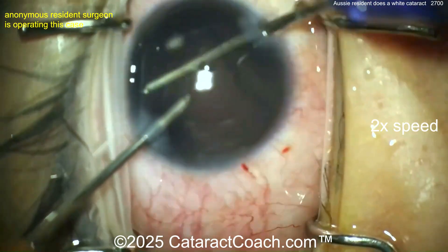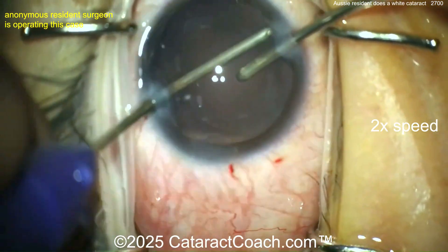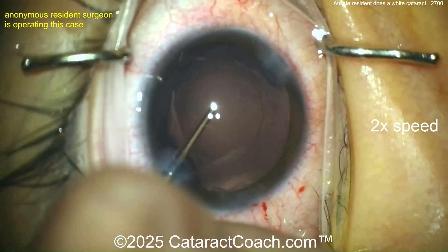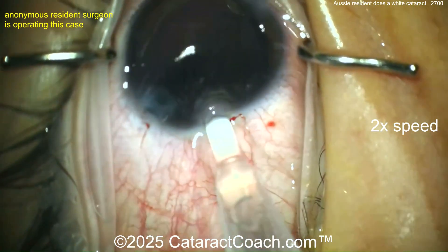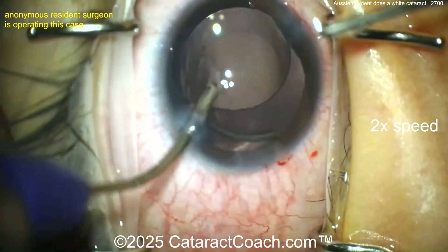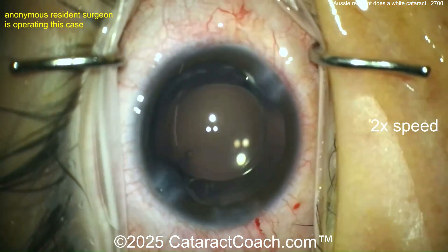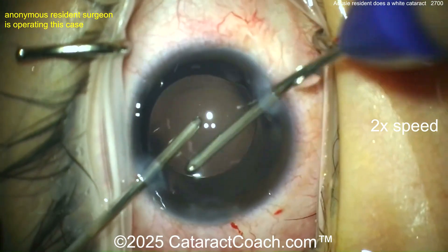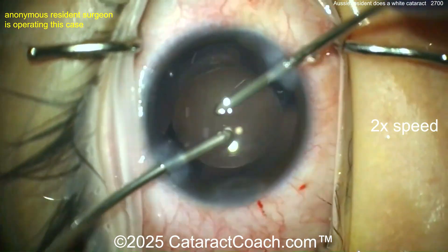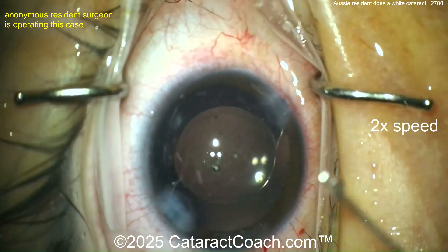Let's see what you're going to do for the lens — are you going to do a hydro-implantation or put some viscoelastic in? Obviously in this patient you need to have zero phaco energy. This is a relatively young patient — you can see those eyelashes look pretty young. Now here is the viscoelastic filling the capsular bag. What would you aim for in this young patient? Let's say it's a bilateral cataract — probably plano is okay, but what about a little myopia in one eye, maybe minus one, minus 1.50 in the other eye? If the patient started off myopic, maybe a little myopia in both eyes. Look at that nice rhexis overlap — really quite beautiful. This is high myopia like we suspected. Maybe even leaving the patient a little more myopic — one eye minus one, the other minus two — that's a pretty nice outcome, giving freedom from glasses for most indoor activities, then just putting on glasses to drive or see distance. Fantastic result.